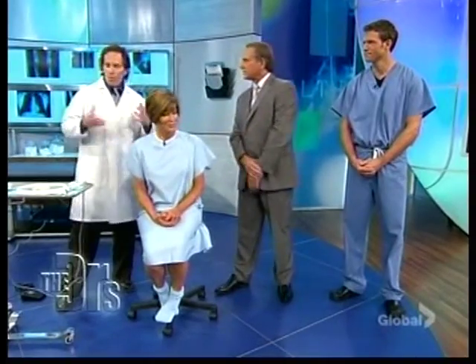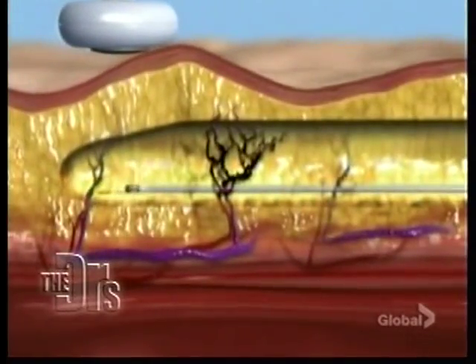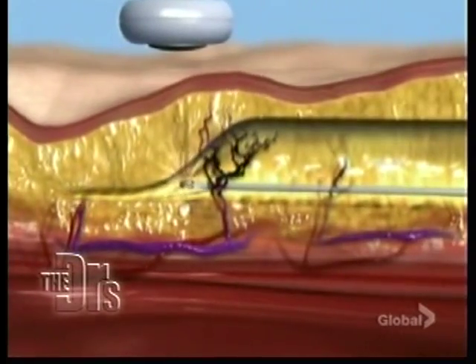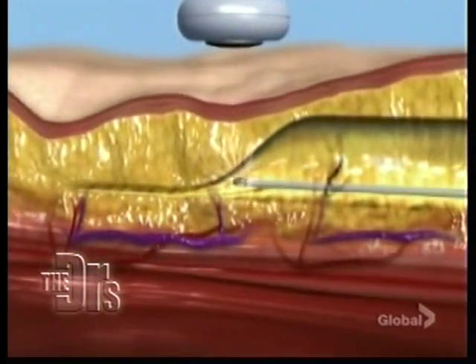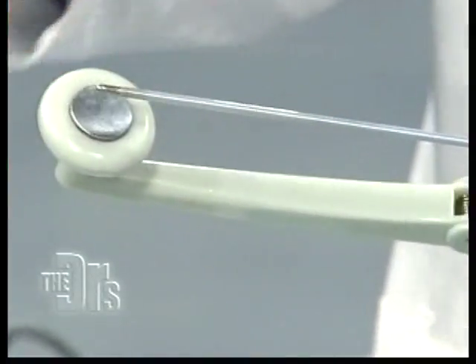So tell us how it worked. Well, what ends up happening is we're putting in an electrode that has a suction cannula attached to it. And when we put it underneath the skin, that's generating some heat and at the same time sucking out the fat. On the top of the skin, there's a thermistor, or kind of like another electrode that's giving you the idea of exactly what the temperature is on the skin surface. And that gives us 2 good things. Number one, it's safety, so you know it's not getting really hot. And the second thing is you want to make it hot enough so that the skin actually will retract.